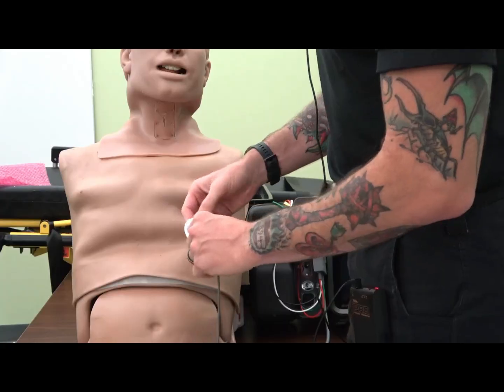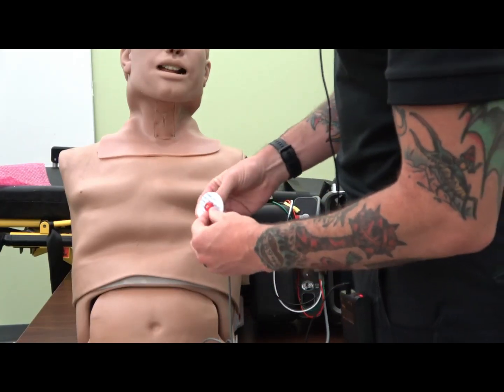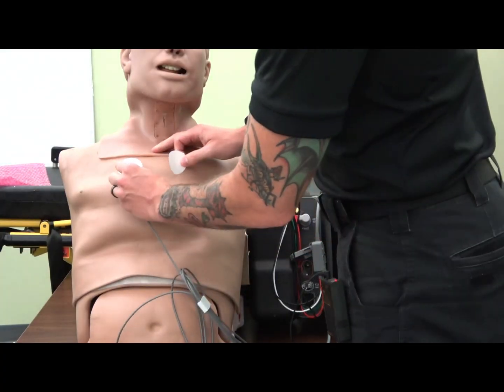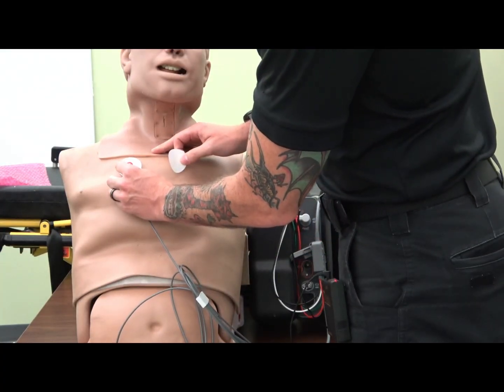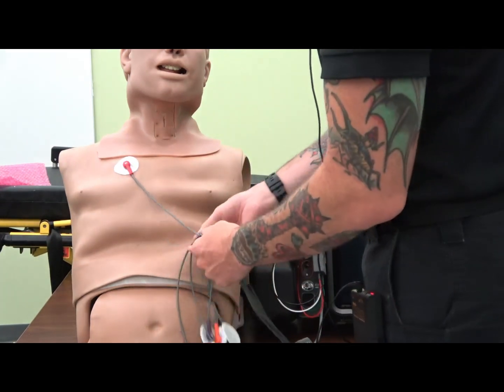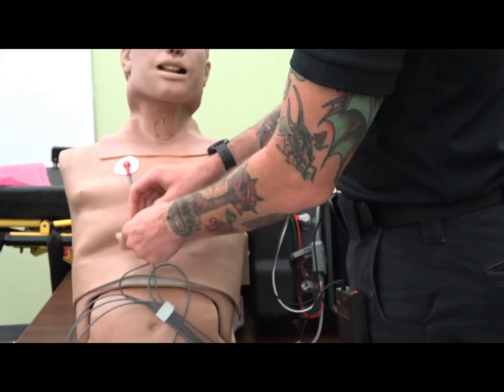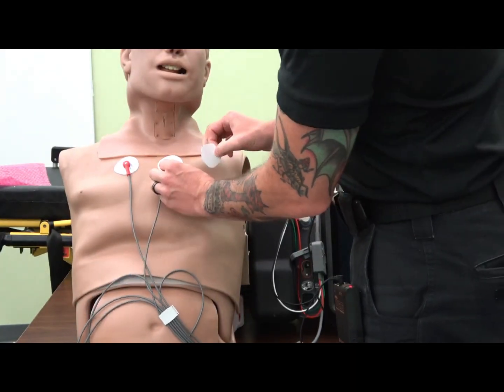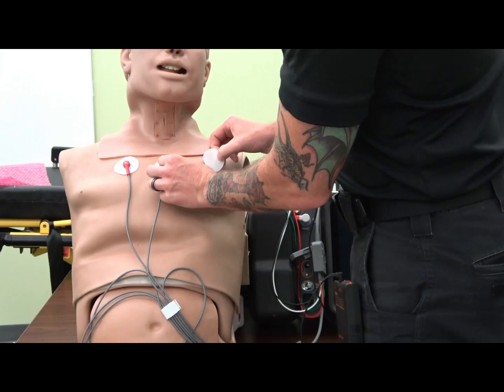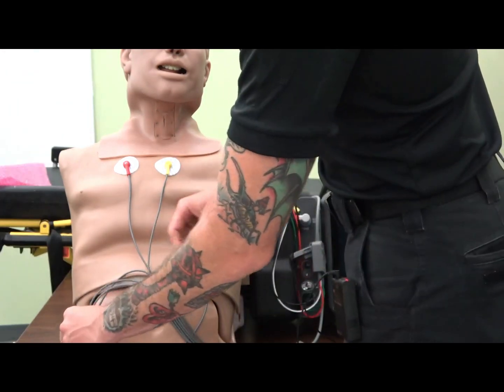That's going to be 4th intercostal space, just on the right side of the sternum. We'll put it about right here. V2, 4th intercostal space, left side of the sternum. And then we're going to drop down to V4.